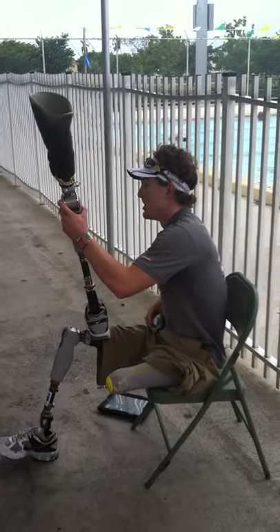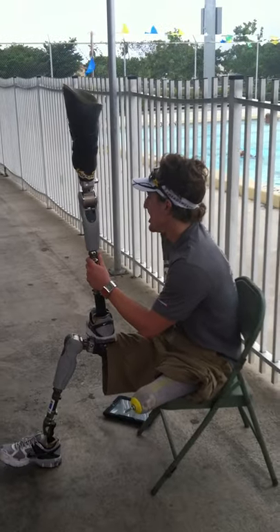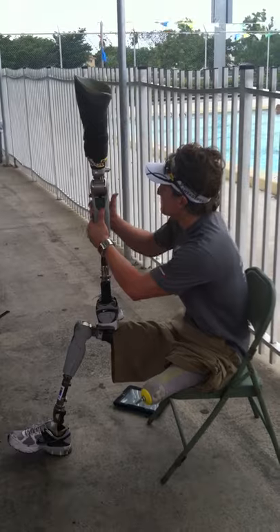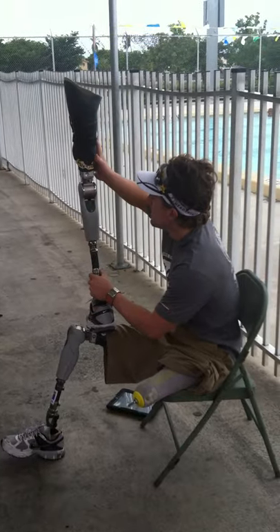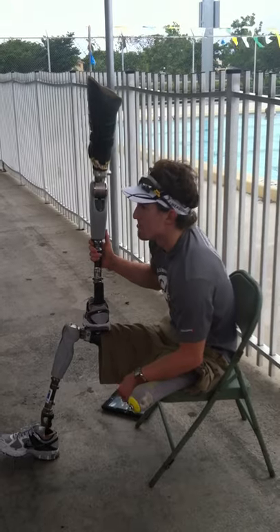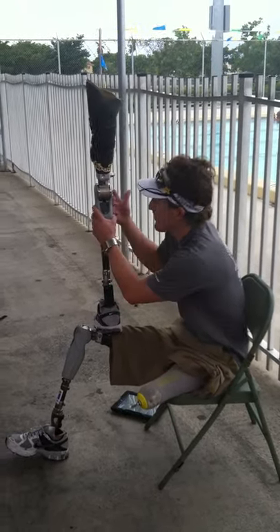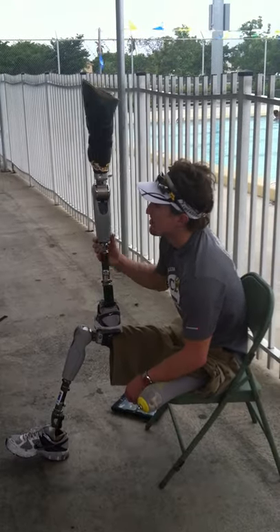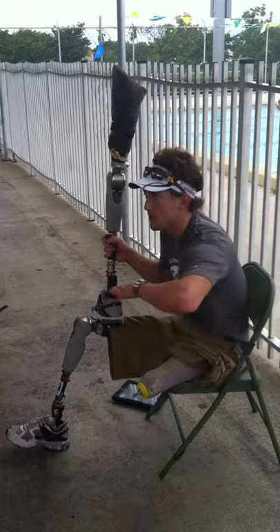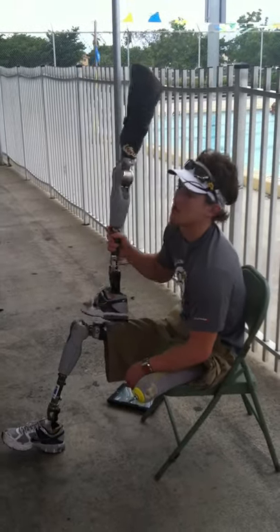These knees right here are like $20,000, so they're very expensive. Someone asked me last night how I afford all my legs — the company that makes them is based in Iceland. They've been supporting me since I was eight years old and provide me with these high-tech prosthetic legs. The foot is basically a carbon fiber foot — it's pretty lightweight and pretty solid as well.